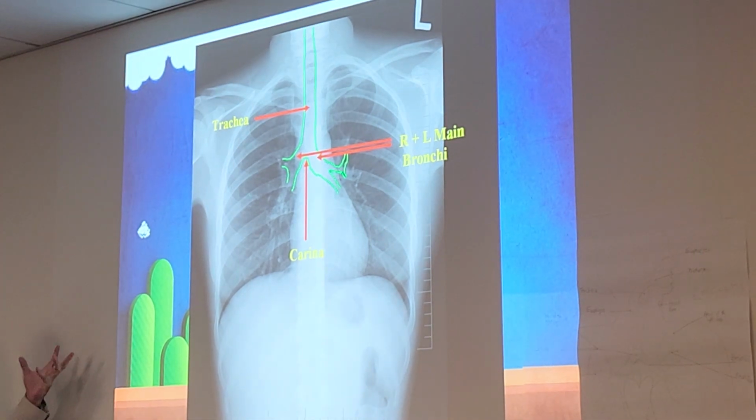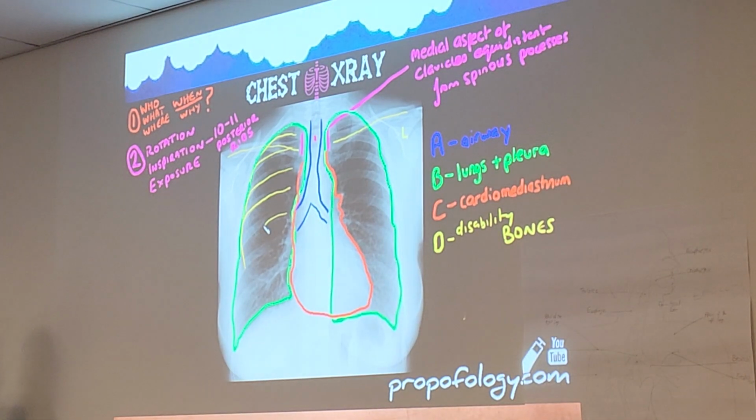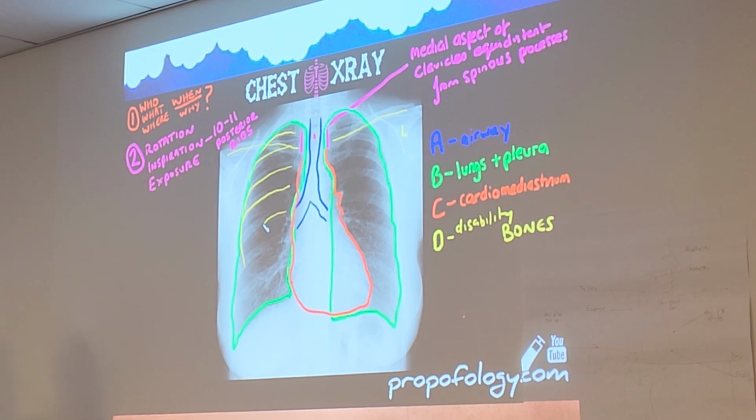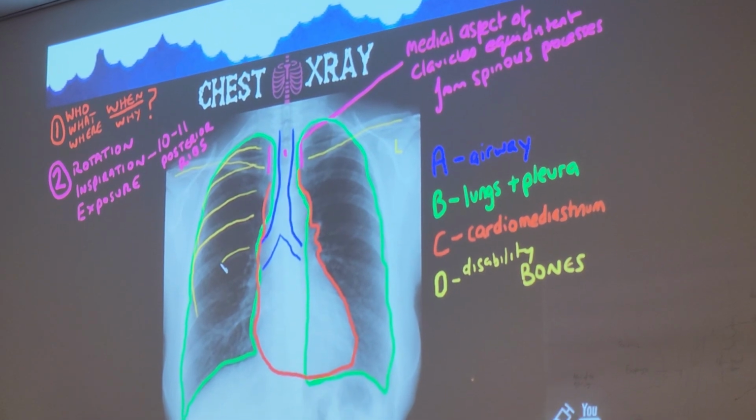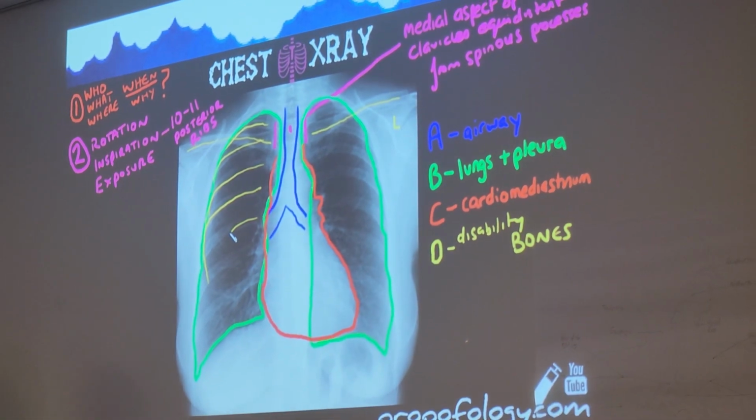And of course, everything in between that we can label, which moving forward, we'll take a look at some of that. Y'all remember these little drawings, these little things to reference. Remember when we're labeling a heart on an x-ray, we don't actually call it the heart, we call it the heart shadow. Once again, we also don't call it just the trachea, it's the air-filled trachea. We do call the carina the carina. Of course, right and left lungs.